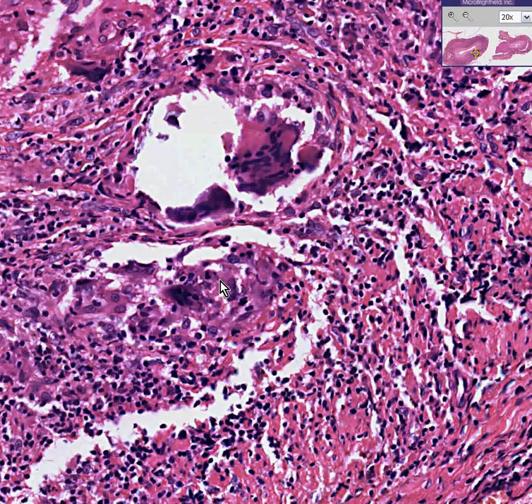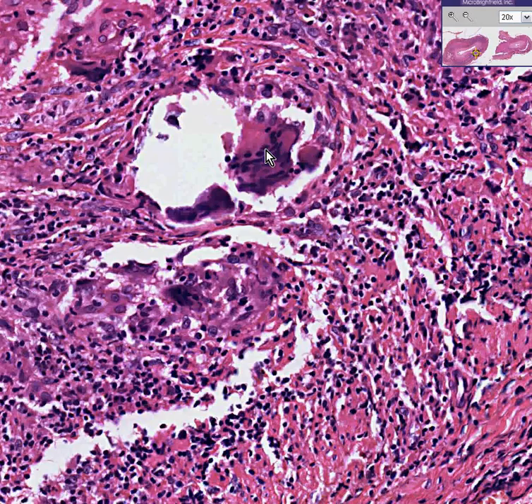Giant cell arteritis, also known as temporal arteritis. And here is the nicest giant cell we've seen so far. Thank you very much.